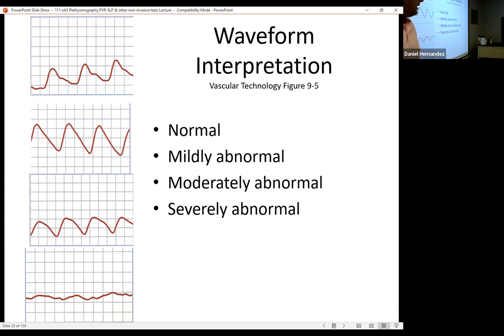I have a question. I was working in the vascular lab this summer, and I was wondering what verbiage you would use. I know how I would say it, but they want their specific verbiage. How would you describe these? Even the most seasoned will ask, what do you think of this waveform? I'll ask Kyle, to get a second opinion. It's better than having to guess. You ask each other, what do you think of these waveforms? Yeah, that's normal, maybe mild. So you could ask people's opinions.